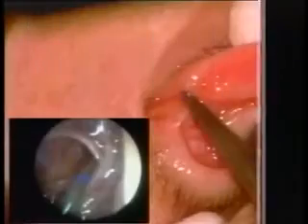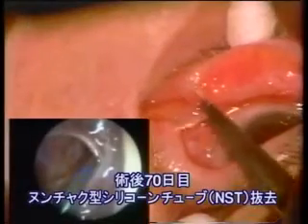Rhinostomy is created in the membranous nasal lacrimal duct which runs on the temporal wall of the inferior nasal meatus using a semiconductor laser.